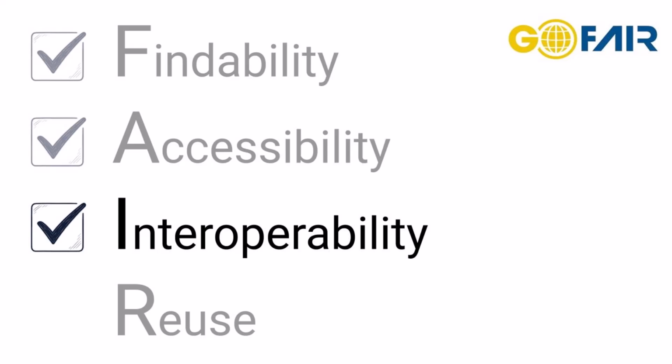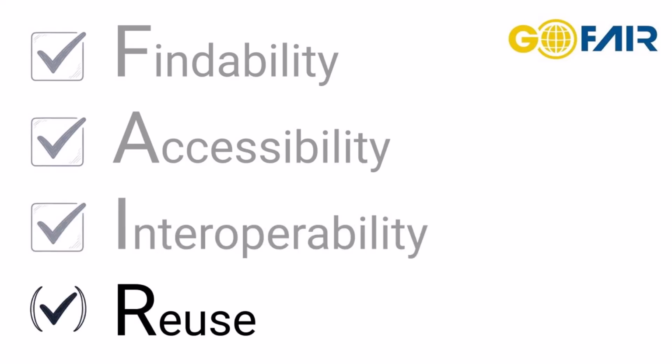Finally, reusability is only partially fulfilled. The metadata includes just a few fields: superclass, subclass, resolution, image ID, and patient ID. While this is helpful, it lacks deeper contextual details, such as information about the microscope or scanning settings, which would enhance reproducibility and reuse. The LungHist700 dataset fits well into the broader ecosystem of lung cancer datasets.